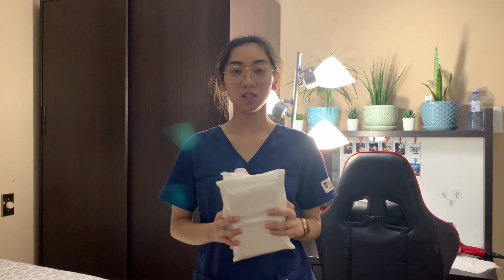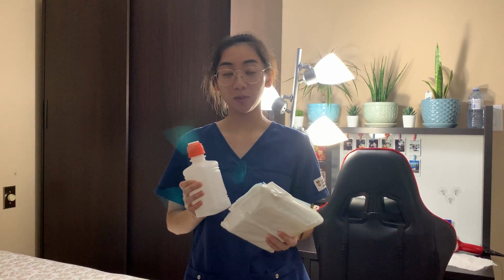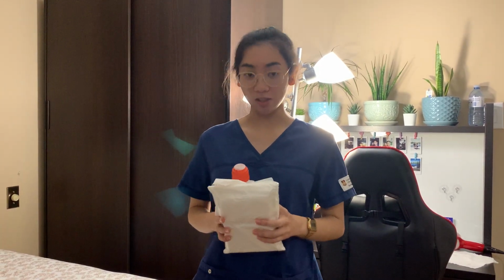I'm a student nurse, and today I'm going to be doing a chest tube dressing change. So I have already checked my doctor's order, and Miss Linda Clark is due for a chest tube dressing change today. I have already gathered my supplies, and I'm ready to enter my patient's bedside.